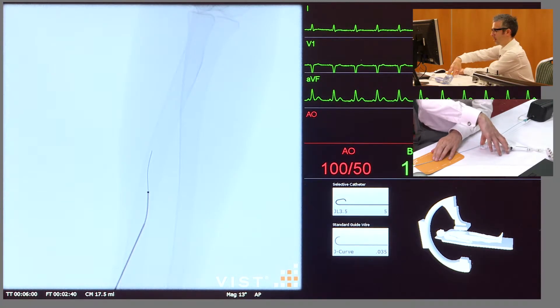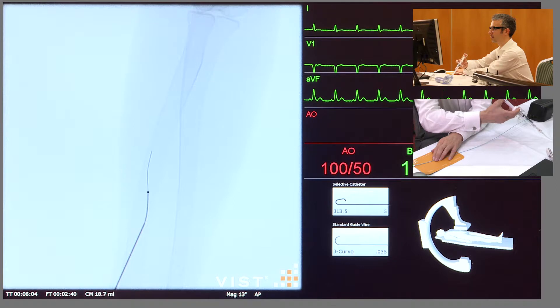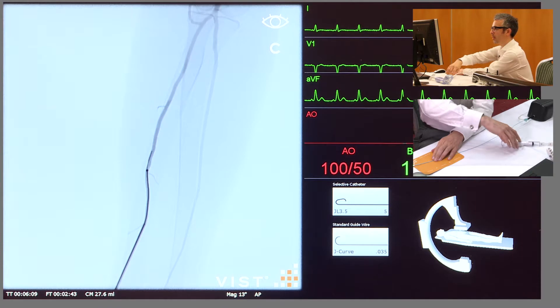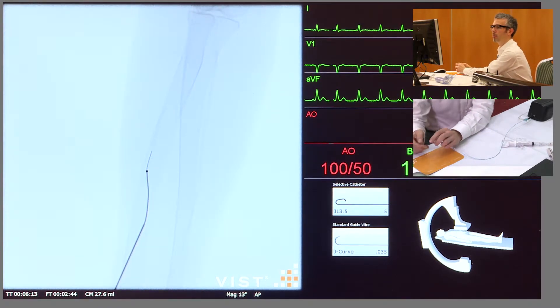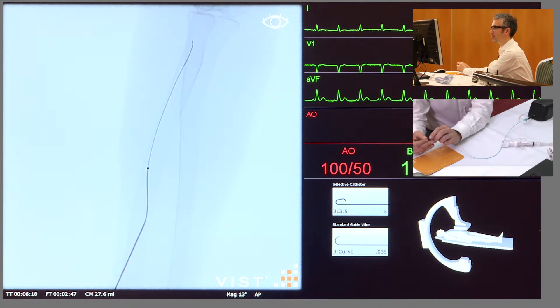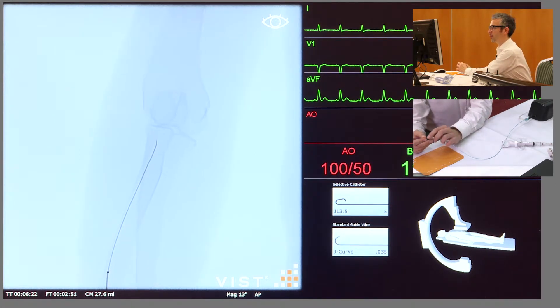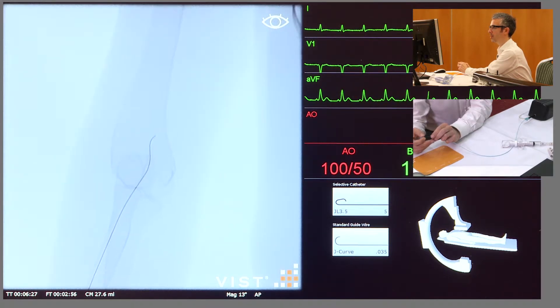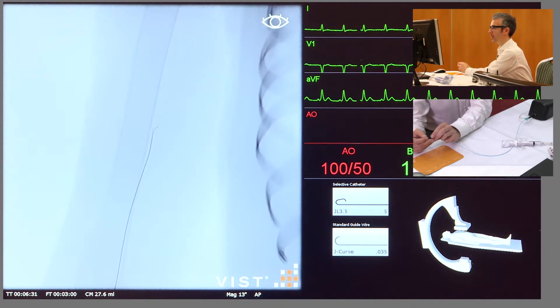Taking an angiogram here, the wire is going into a small branch but doesn't seem to be any particular problem. I now have a very detailed roadmap to show me where I need to go, and we can see the wire passing on fine there. As we come up to the elbow here, this is commonly where the wire can get into some small branches, but there we saw it negotiate the arm without any problems and it's heading up now in the brachial artery.